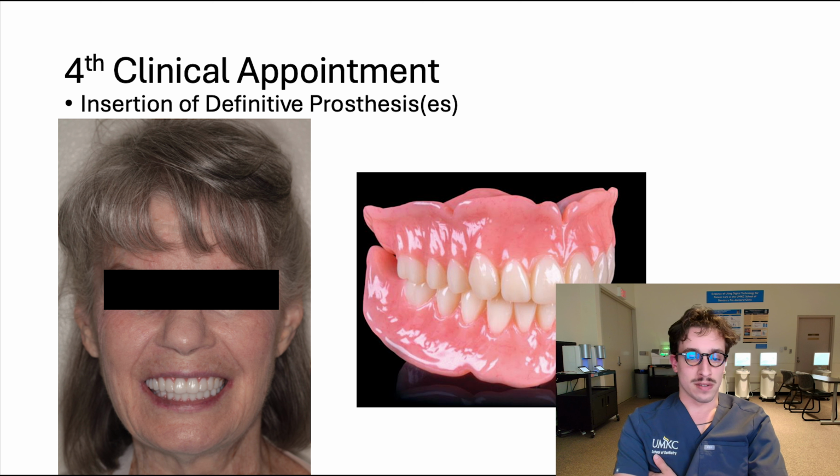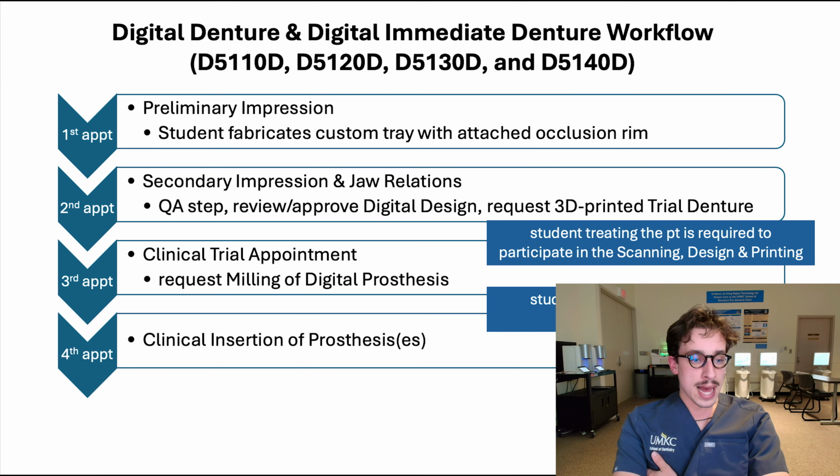It really is impressive. And also the occlusion that the labs are able to generate with these is really impressive too. I've been blown away by all the ones that I've been able to do and deliver, that the way that they occlude is just beautiful. It really is impressive. And so that just about does it for all of our clinical appointments.